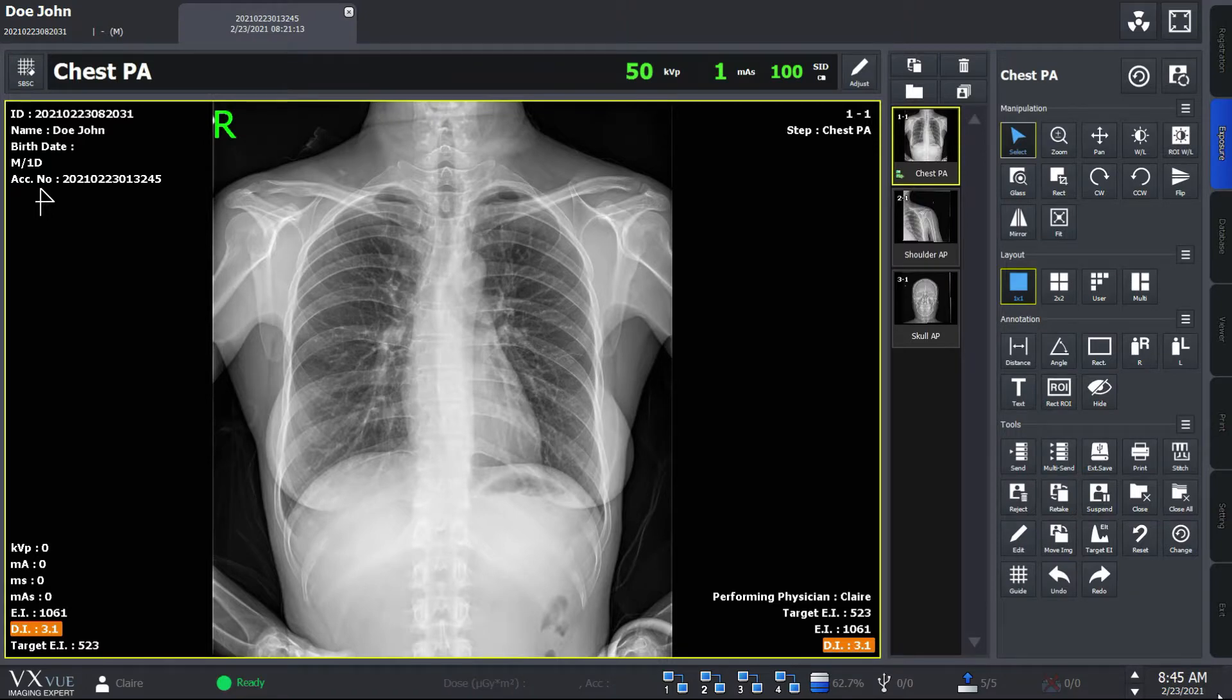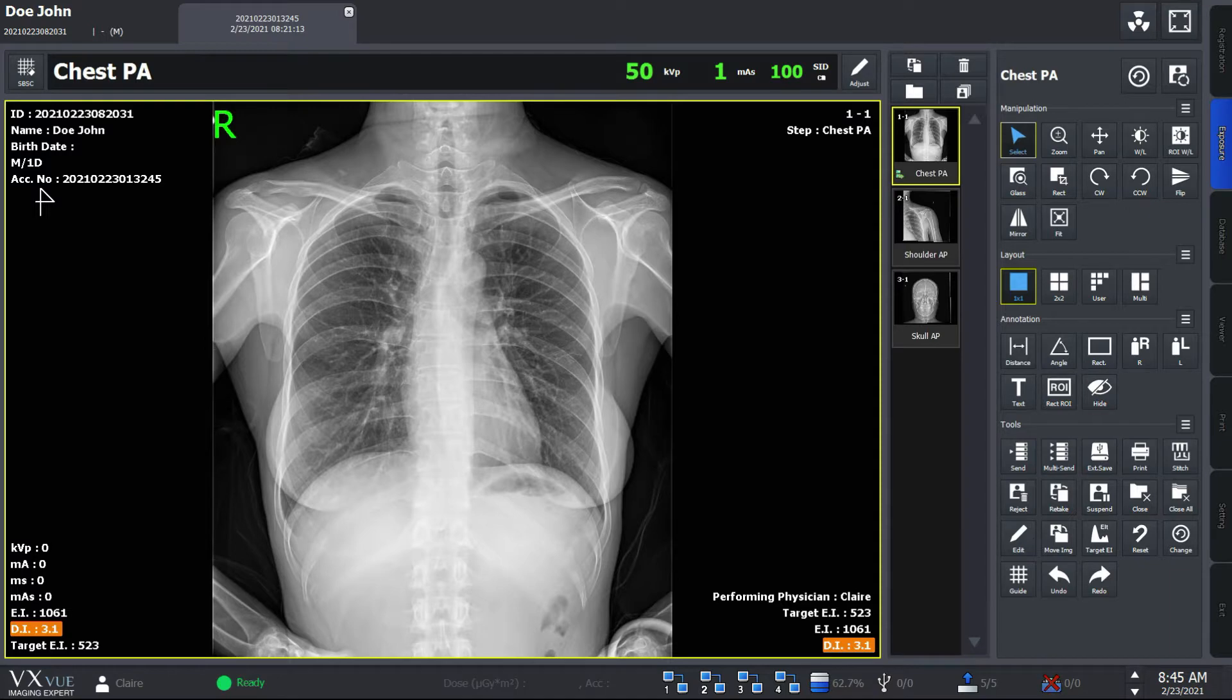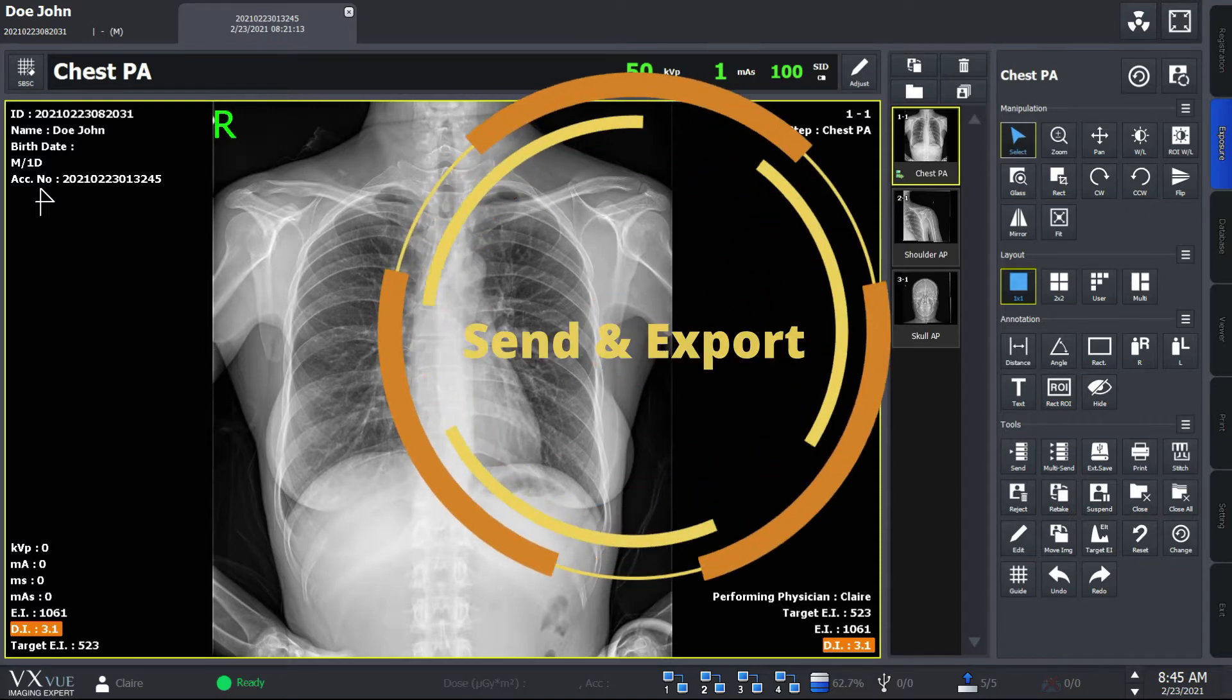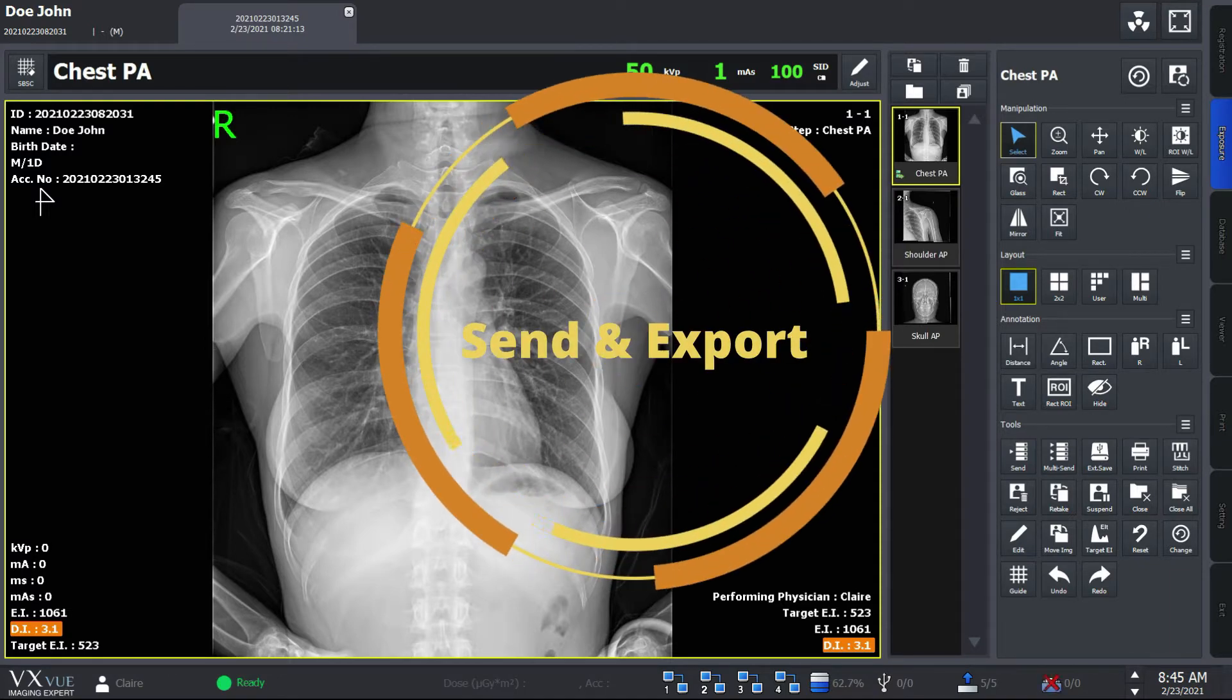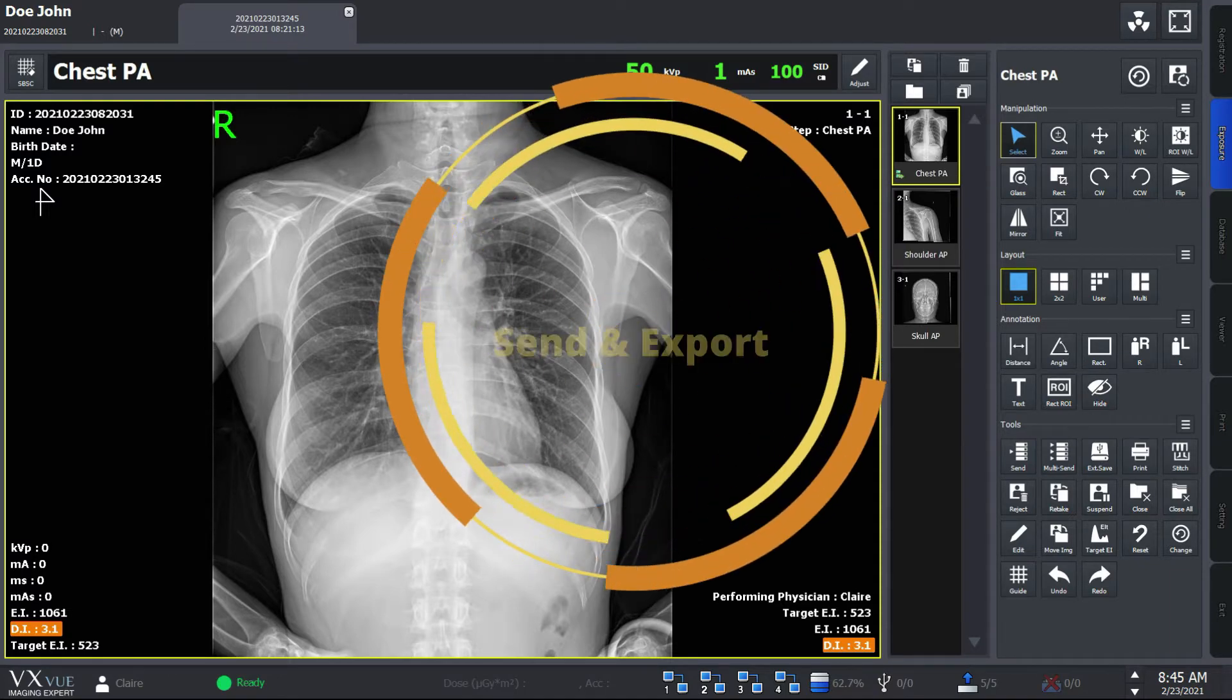Welcome back to VWorx VXView quick guide. My name is Claire Pyun and today's video will be on sending and exporting your x-ray images.